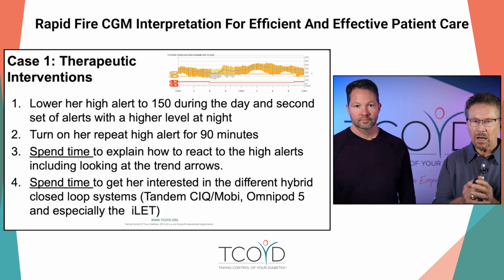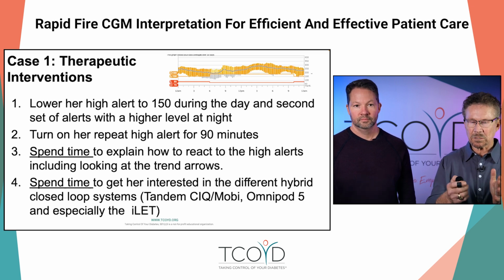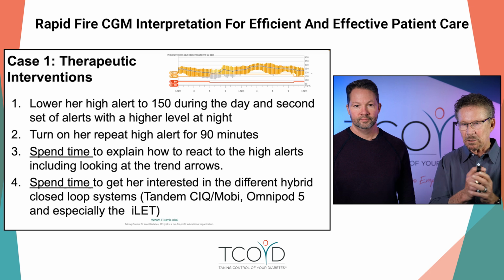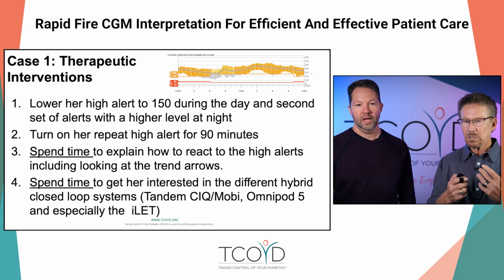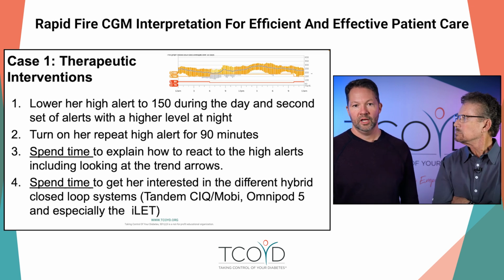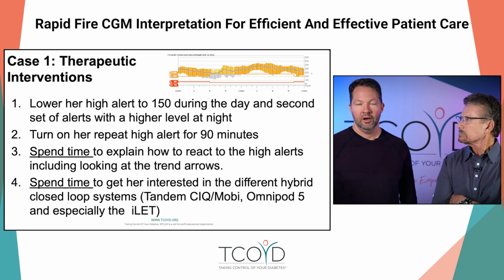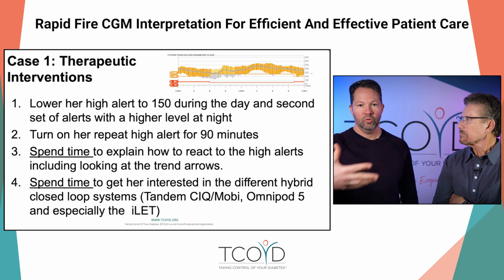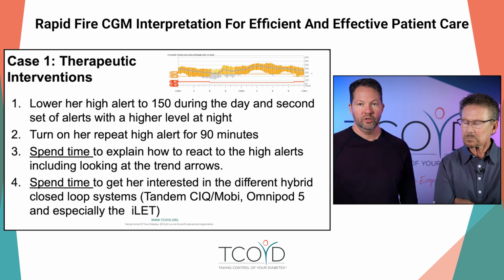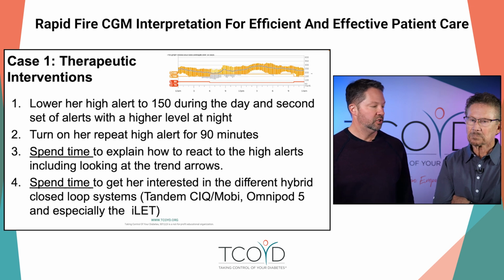And I think it's worthwhile trying to talk her into one of these hybrid closed loop systems. And you can see at the bottom, I said especially the iLet, which is a pump that requires very little input from the user. Yeah. And we did the original clinical trials with that system, and it was exactly this patient that did the best with the iLet. On MDI, A1C elevated. They're comfortable letting go of control and letting the system bring them into range. And in general, people can get down around an A1C of 7 without doing so much.